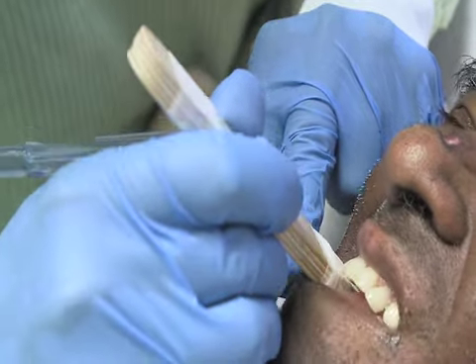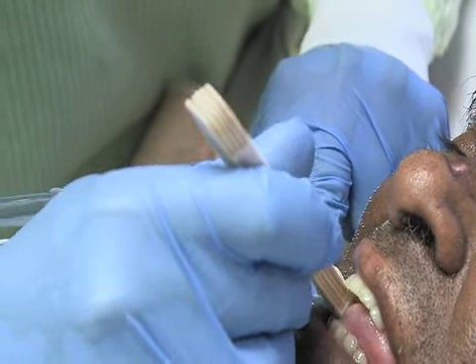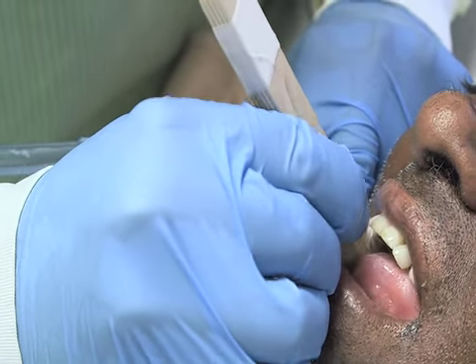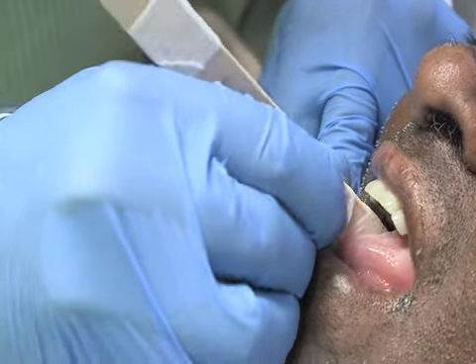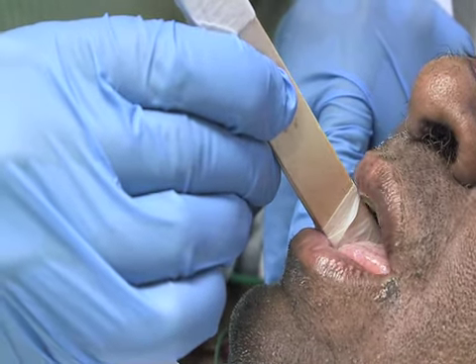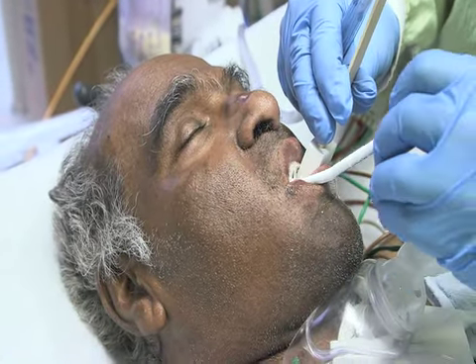To insert a mouth prop, wiggle the device in between the back teeth. Don't insert between the front teeth as you risk chipping or breaking the teeth. Turn the mouth prop so that its wider aspect is between the back teeth. This allows for more room to provide oral care. Repeat this insertion technique to clean the opposite side of the mouth.